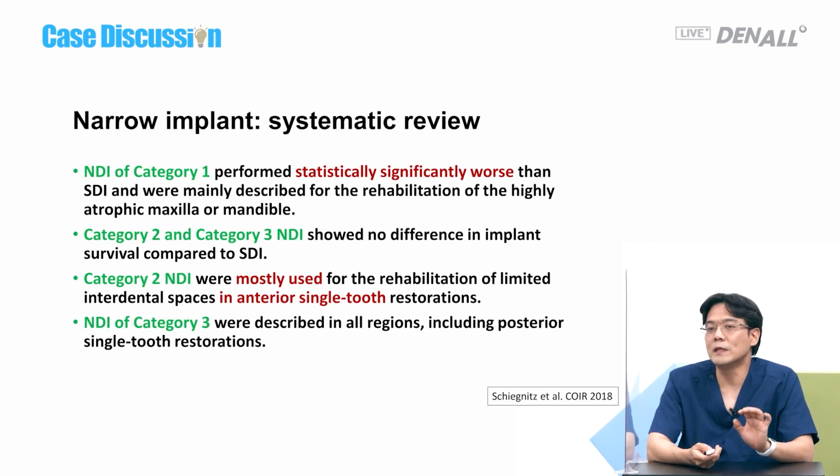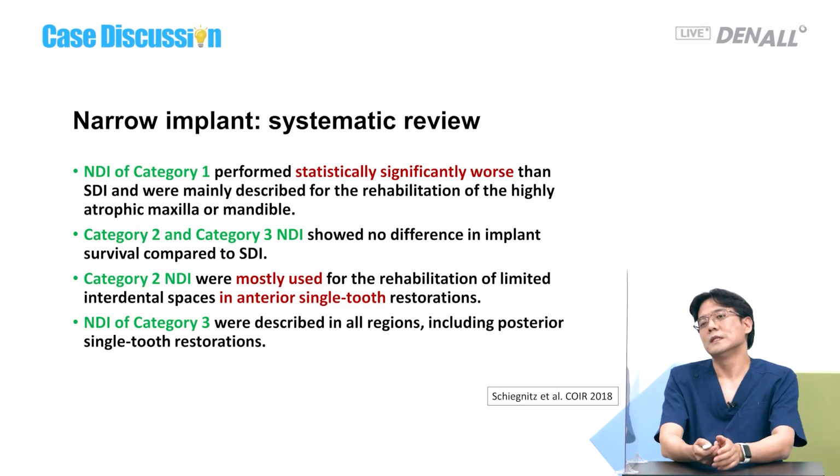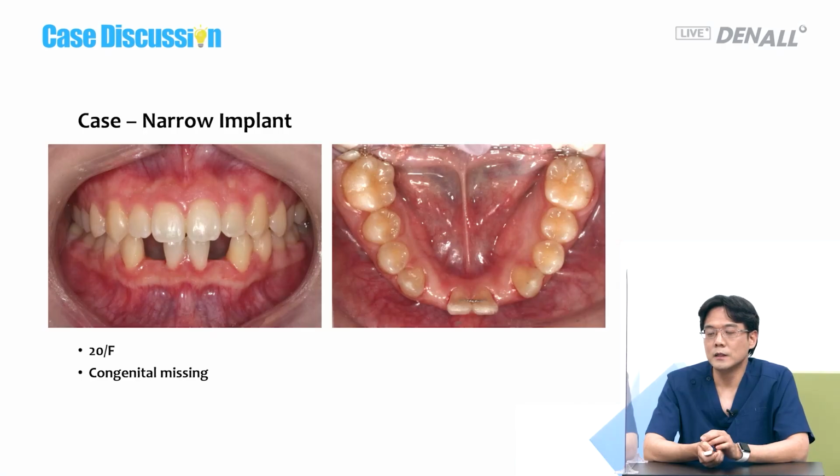3.3 to 3.5 thicker implant, there was no significant difference. It is also placed in posterior region, premolar, therefore, so the conclusion was derived. We cannot reach a conclusion based on these two papers. We need to review more papers. I don't try to use one-piece implant because our prosthodontists do not like it. I try to use two-piece implants as much as possible.